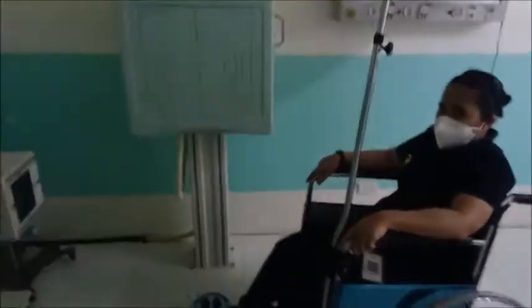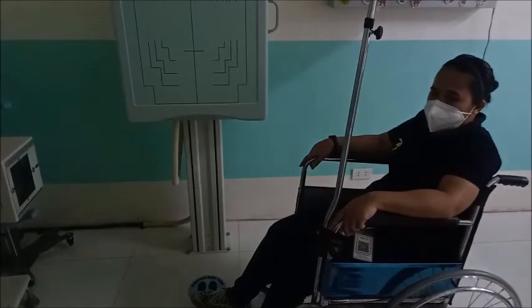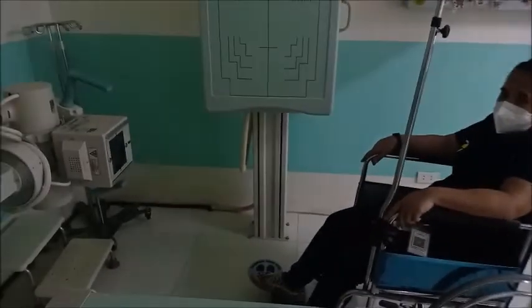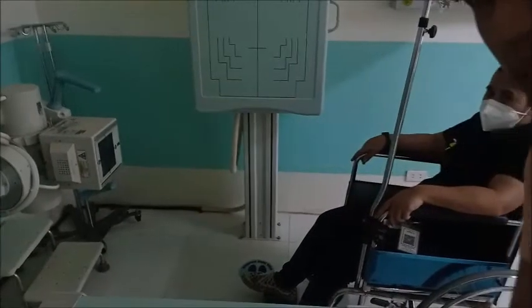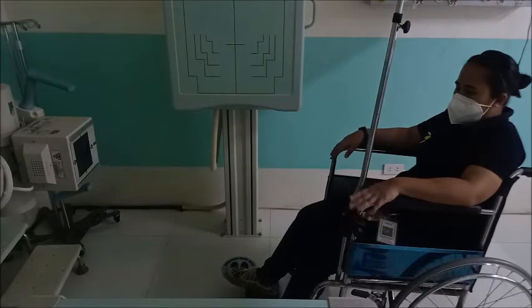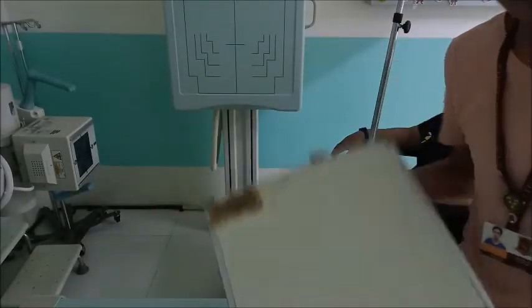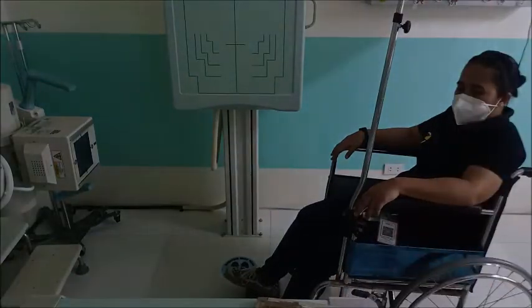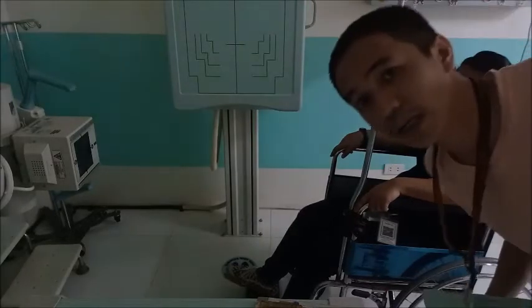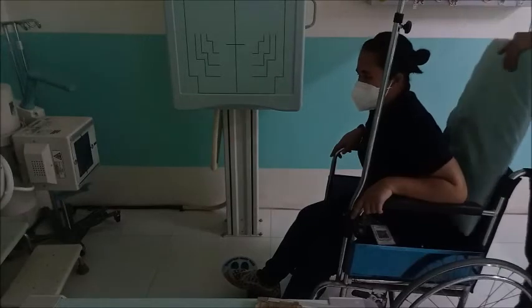Okay? So, naay X-ray tube. Dito nga side. And then, you have your patient. Then, for this examination, di na ta kailangan og grid. Or maybe you can also use grid if you have the stationary grid. So, you can insert a pillow direct.